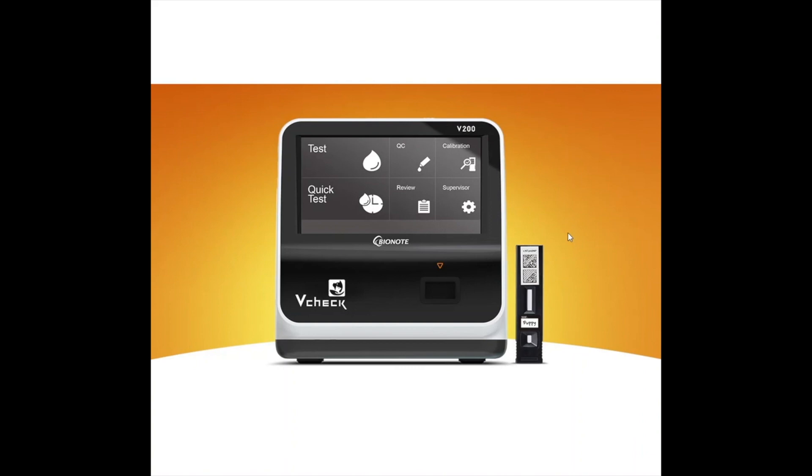It's covered with a two-year replacement warranty, which is probably the highest in the industry. It's a touchscreen, like I mentioned, and all the functions are super easy. It's LIS enabled, and you can also connect a network to it.